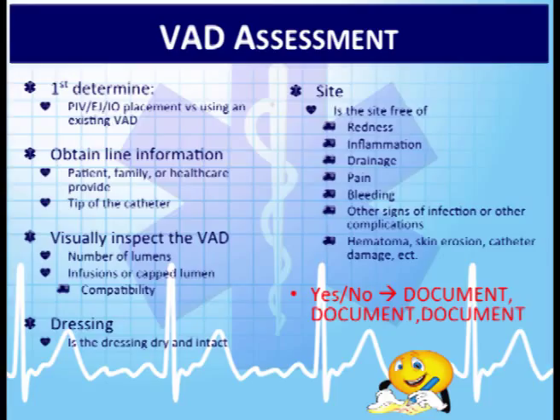Hematoma, skin erosion, catheter damage, etc. We would want to document the site assessment, what it looked like, or if there were problems with that site assessment, make sure we document.